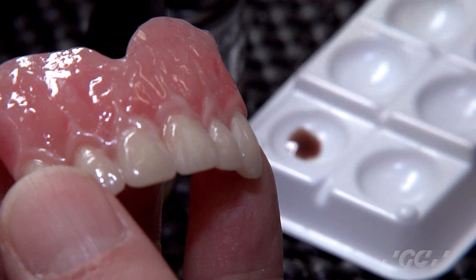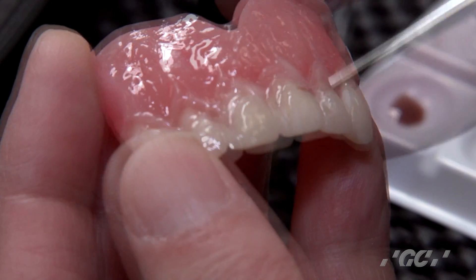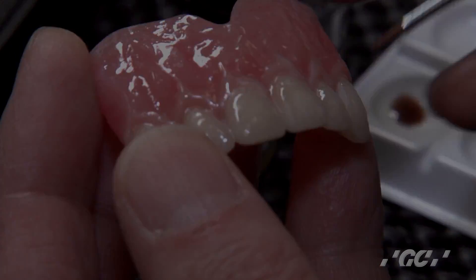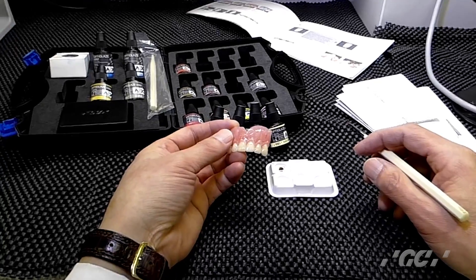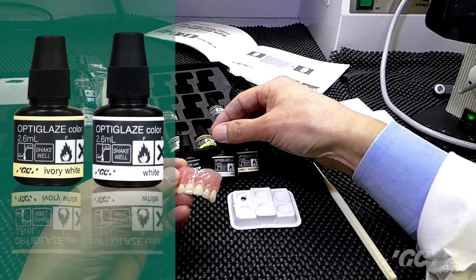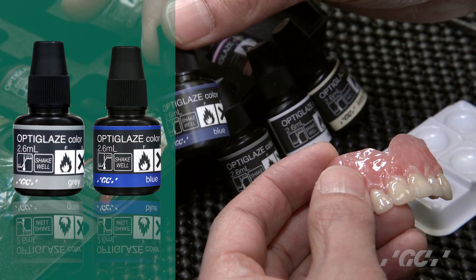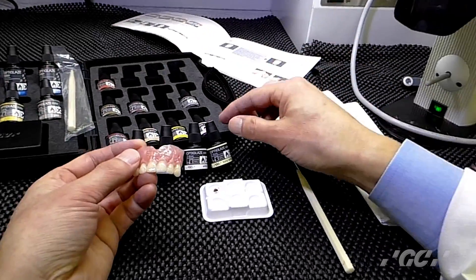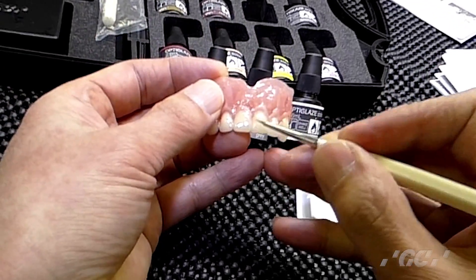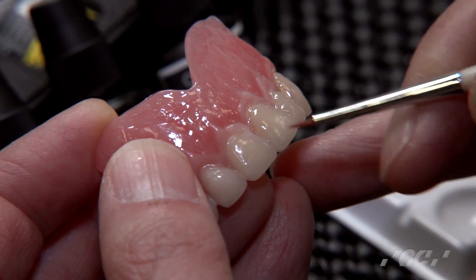If you want to dilute it, add just a little bit of clear to thin it down. It's very easy to paint because this is actually the same as watercolor or oil paint. Next, if you want to apply some mamellon color, you can use ivory white or white. If the color is a little too strong, dilute it with clear and control the color with your brush.